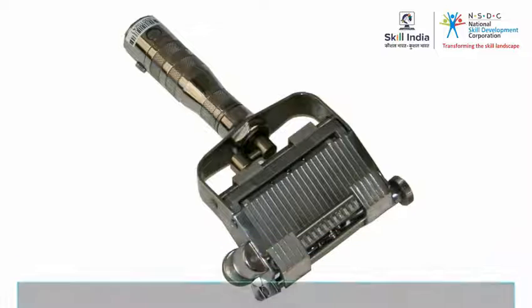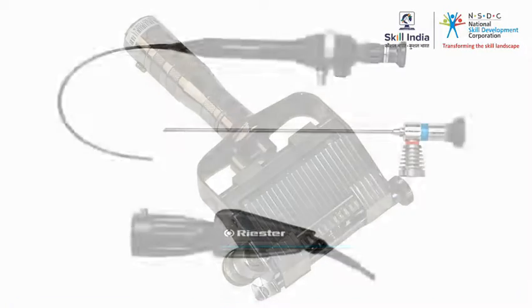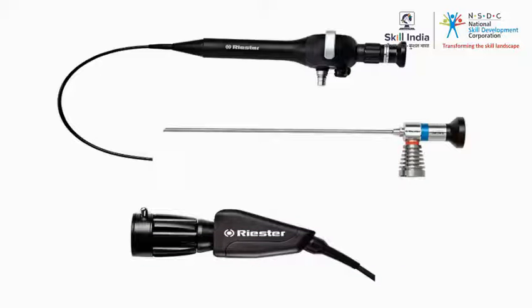Dermatome is an electrical or air-powered device used to slice off thin layers of skin which can then be grafted onto a damaged area. Endoscope is a fiber optic device used to see small body cavities inside the body. They are used in procedures that do not involve large cuts in the body.